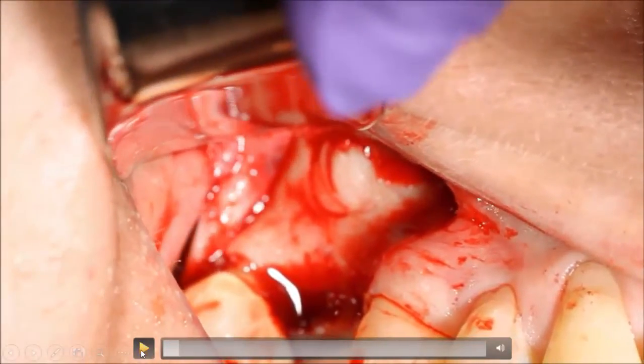Now, the initial mistake in this case, as we can see, is that my flap is small, so I have difficulty in retracting the flap. What I like to do is to extend the releasing incision more mesially. We call it a subgingival or submarginal incision, and then I drop the vertical releasing incision. So I preserve the papilla and the gingival margin of the adjacent teeth, and I prevent any further recession after the surgery.